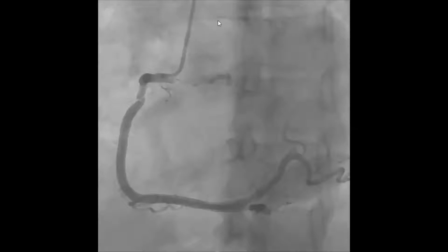So this tells me that I'm looking at the right coronary artery, because I don't have any big vessel of equivalent size arising somewhere here. So a single vessel that bifurcates towards the end is the right coronary artery. Now let this play again.